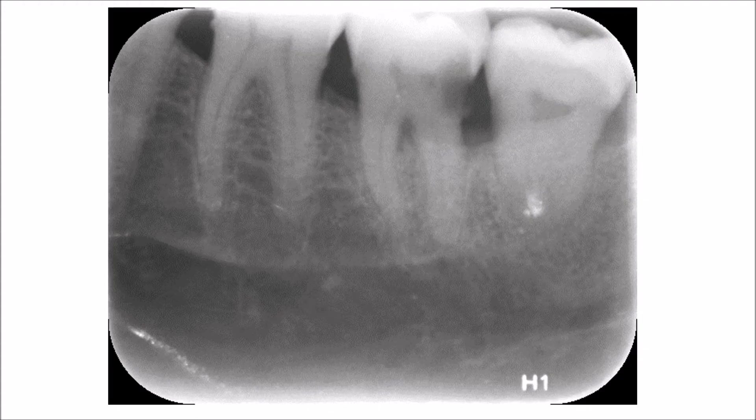This periapical radiograph of the lower molars — first, second, and third molars — shows another case of a patient suffering from periodontal disease, with moderate horizontal bone loss and bifurcation involvement of the lower second molar.